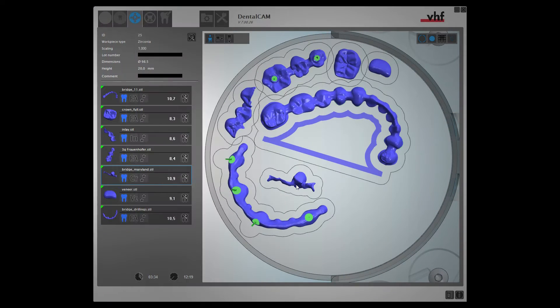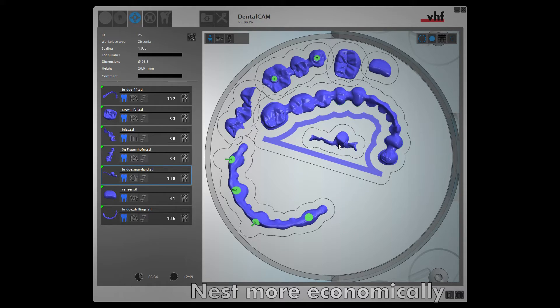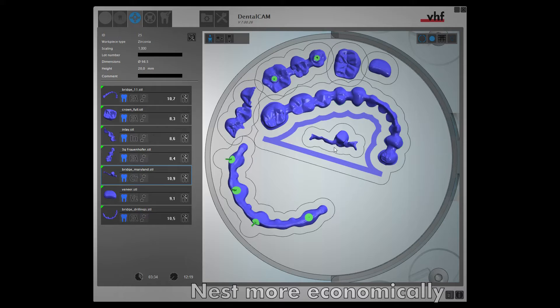When working with closed center bars, you can now nest additional objects in the unused portion, to maximize your disk's millable areas.